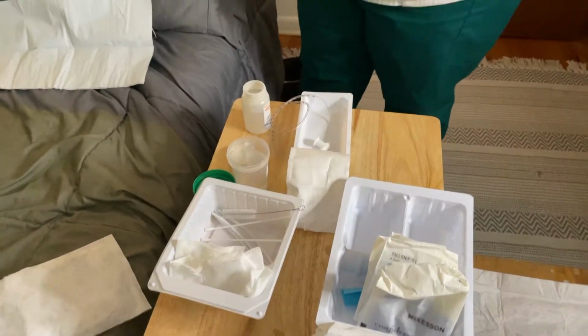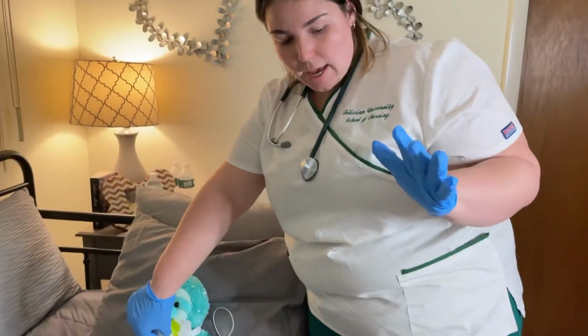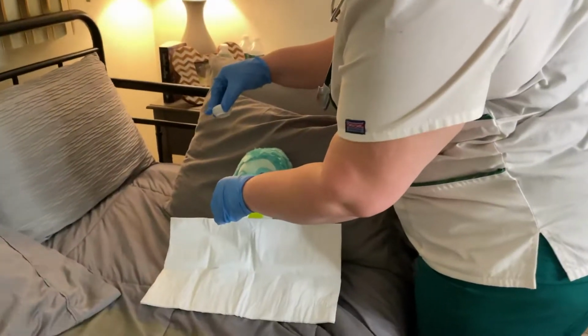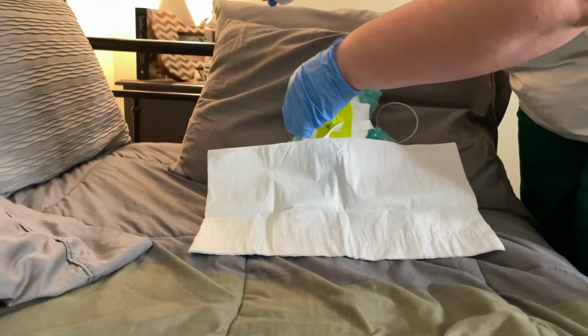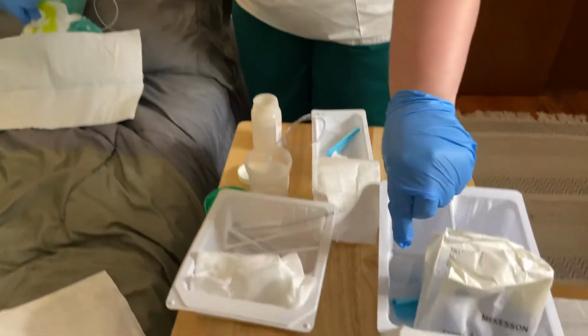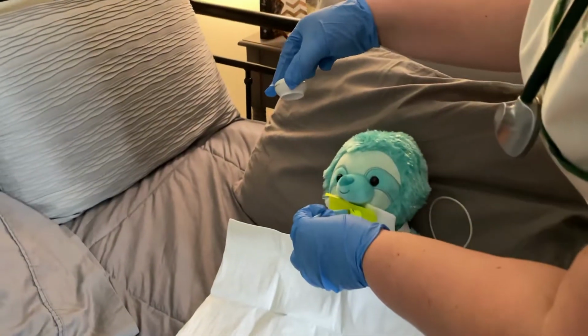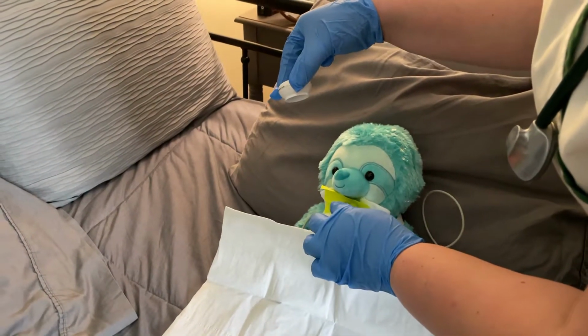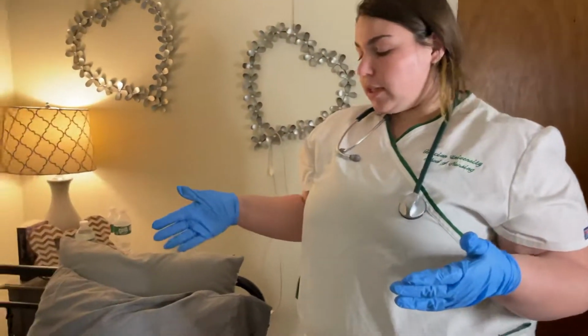Then you're going to use your sterile hand and remove the inner cannula, maintaining sterility. Put the oxygen back on. We're going to take our new sterile inner cannula and put the new sterile inner cannula in, put oxygen back on. So at this point, the new sterile inner cannula is in, the suctioning is done.